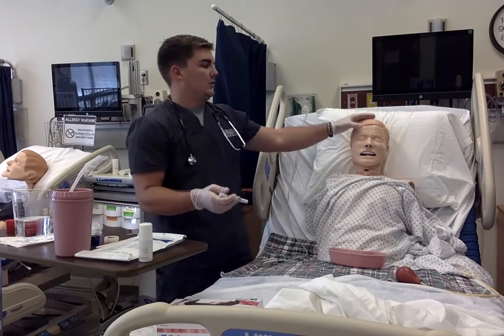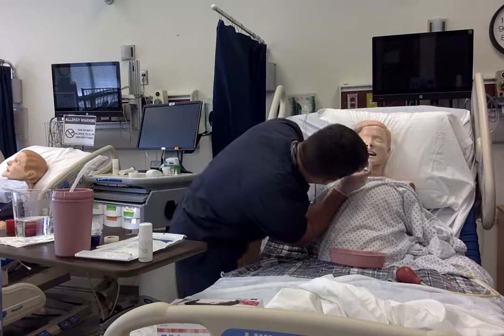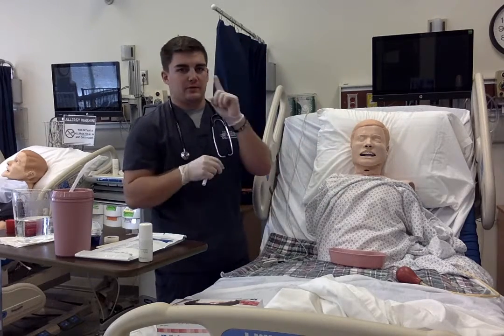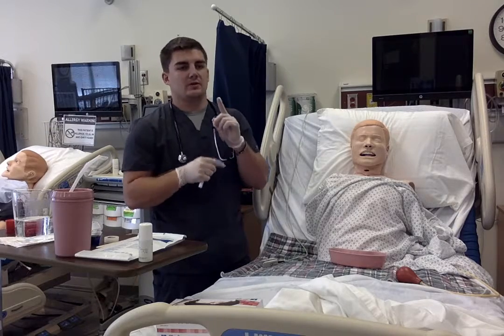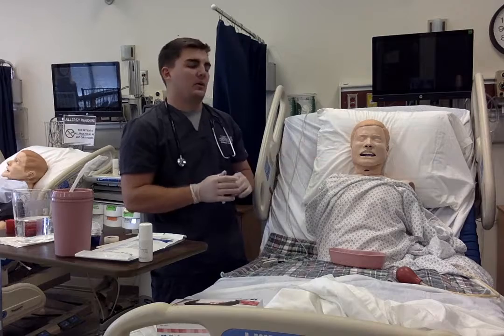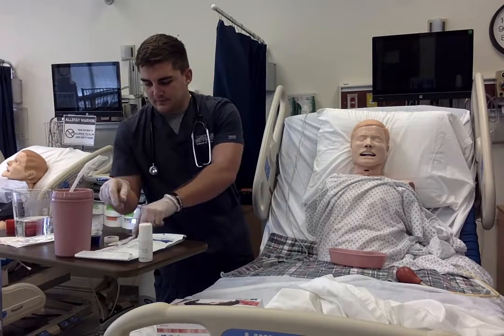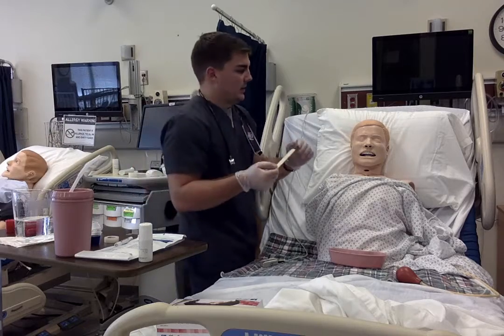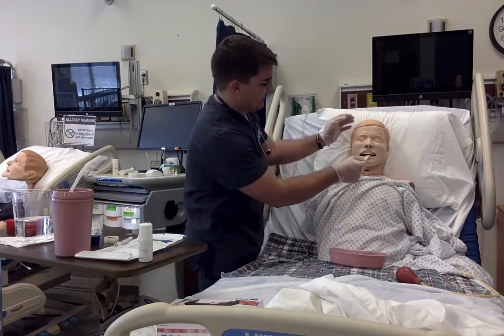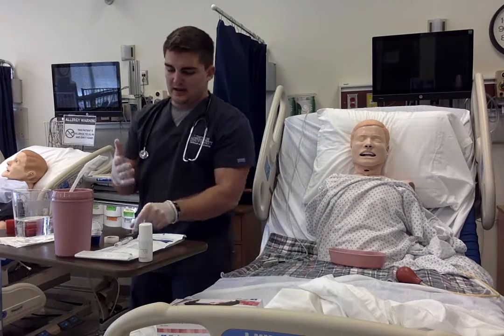First I would look at the nares, looking for a deviated septum and the patency of the nares. I'd ask the patient to press a finger on one side of their nostrils and breathe, and then the other side, to see how well they are breathing, as well as looking for a gag reflex prior to putting in the NG tube. I would put this tube in and see that the patient's gag reflex is intact.